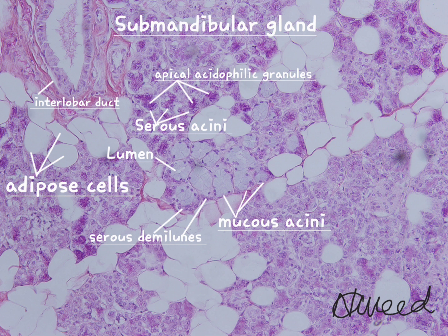The cells of mucous acini are also pyramidal in shape. Their nuclei are oval or flattened and pressed against the basement membrane. The apical region of the cells is occupied by mucin granules, which are washed out during the staining procedure. Under the light microscope, the apical region of mucous cells stains poorly and appears to be empty.